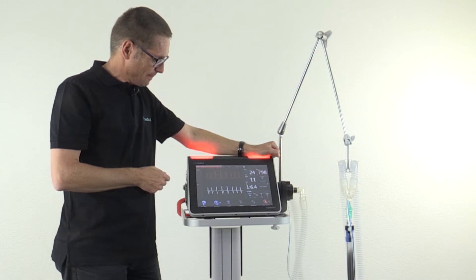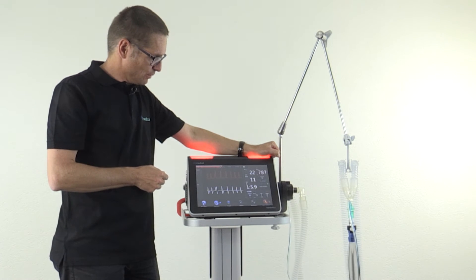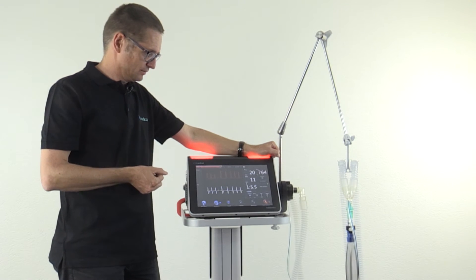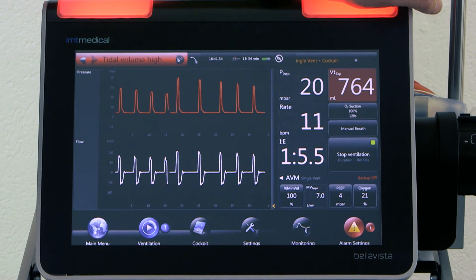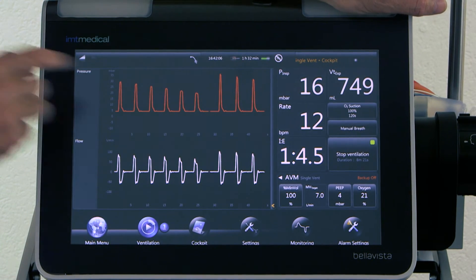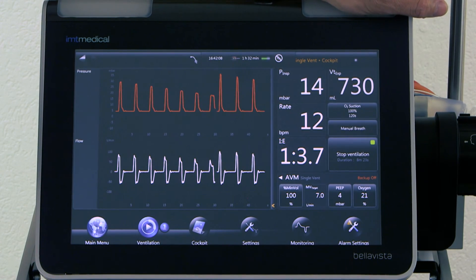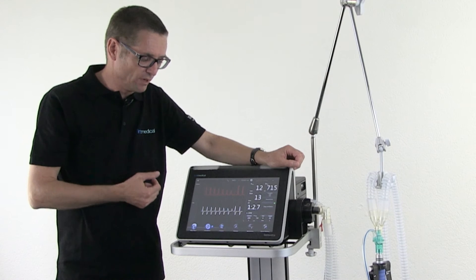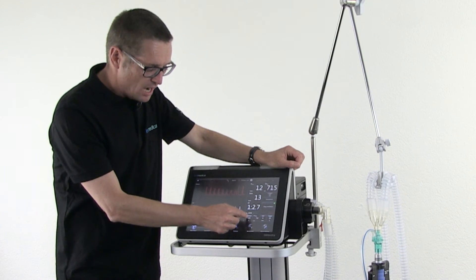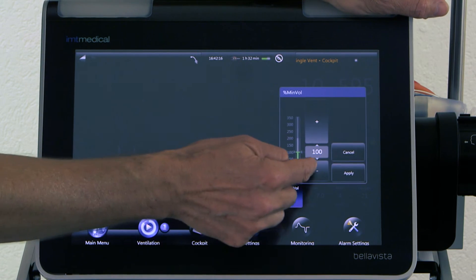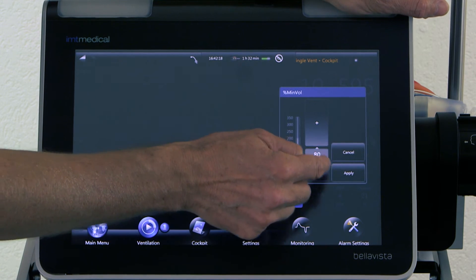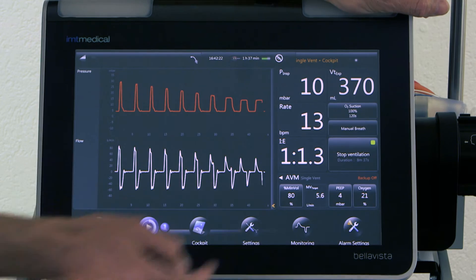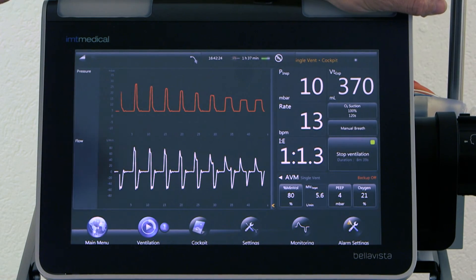It's regulating its way down. This is the patient back to normal. Now let me show you what happens if the patient needs more weaning. To do that I would reduce the minute volume — for instance to 5.6 liters per minute — to make the patient more hungry.